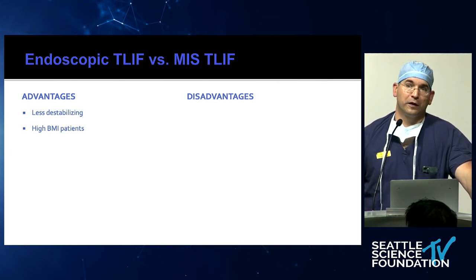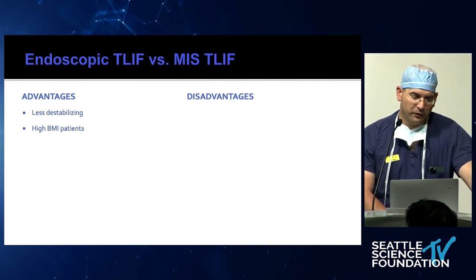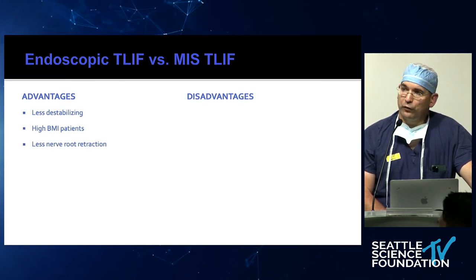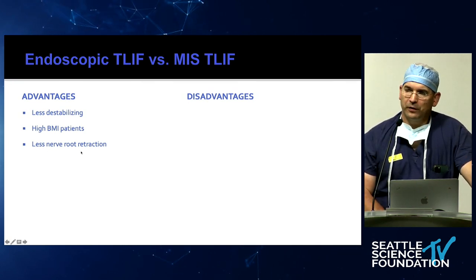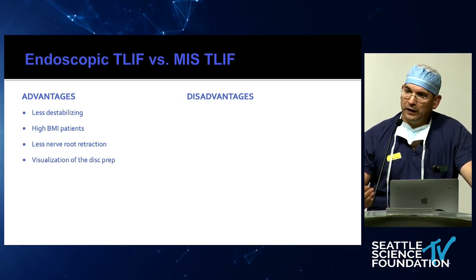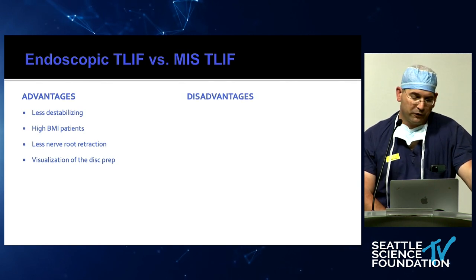You can always call for the long set and get an extra couple of inches, which really helps. So very large patients definitely benefit from the endoscopic T-LIF. There's less nerve root retraction. In this approach we're going to see the traversing nerve root but it's not retracted, because we're right in Kambin's triangle. We can also visualize the disc prep — once done, you can put the endoscope in there and look at the end plates to make sure they have good preparation.